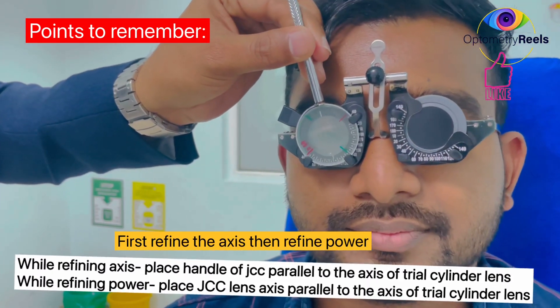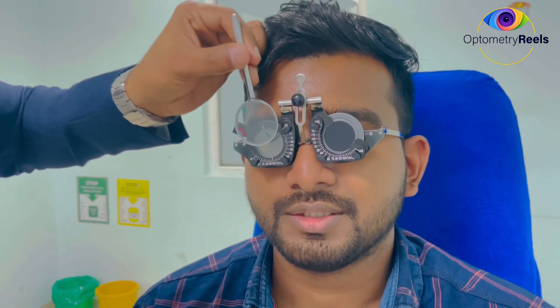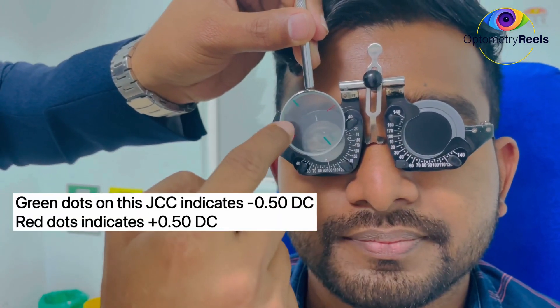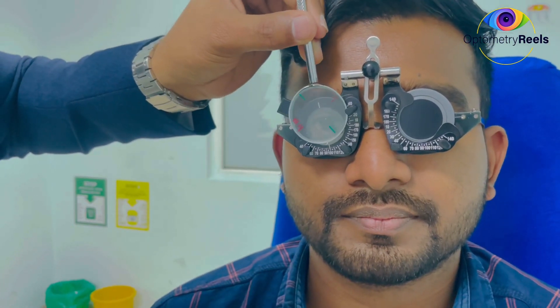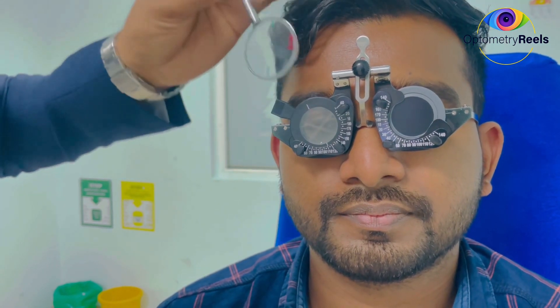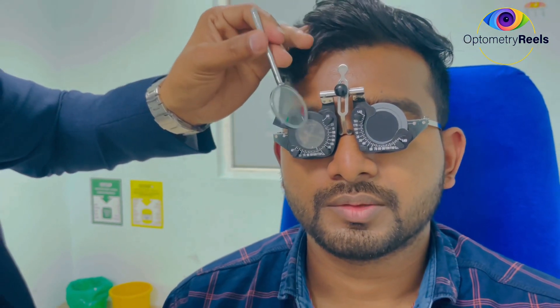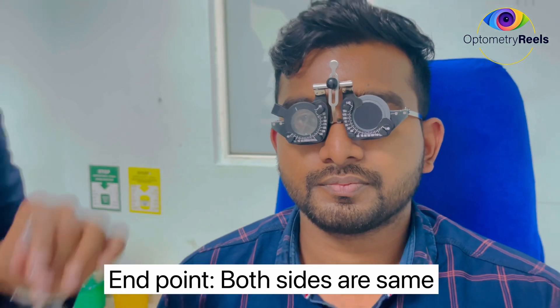Remember that we have to keep this handle parallel to the axis of this cylinder, and you ask your patient which condition is better — condition 1 or condition 2. The patient says this one is better. On the JCC, the green line means minus, so we rotate towards the green side by 10 degrees. We ask again — this or this? The patient says almost the same, which suggests we have achieved the best or accurate axis for that cylindrical power.